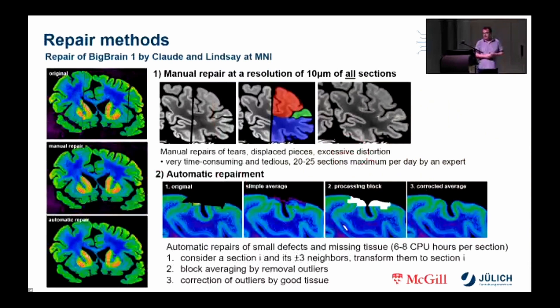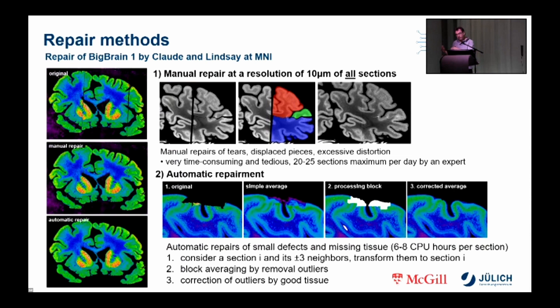In the following, we look at the repair approach as done by Claude and Lindsay for the BigBrain 1 dataset. In the first step, all large artifacts such as shifts — shown in the example above — are corrected manually in all sections. Since an average maximum of 20 to 25 sections can be repaired by one expert per day, this results in an enormous workload. For a typical brain, this task alone took three to four years.